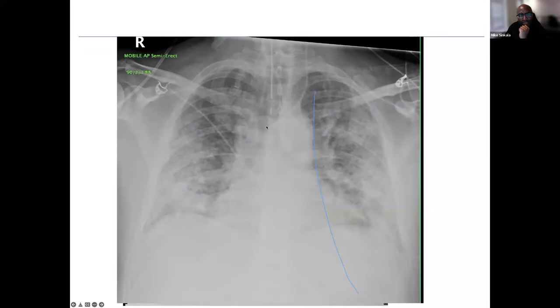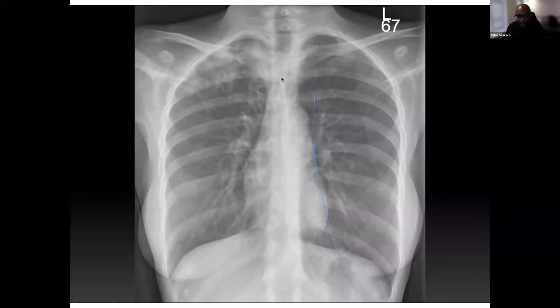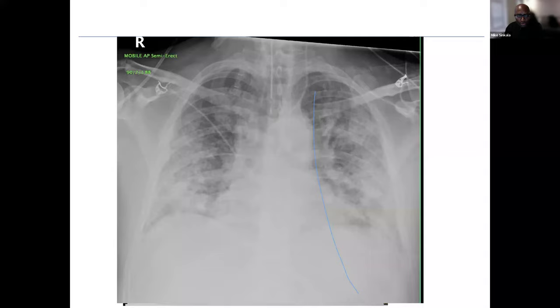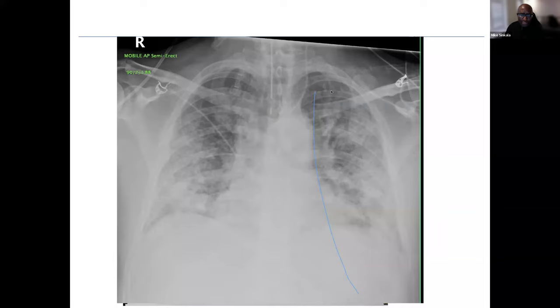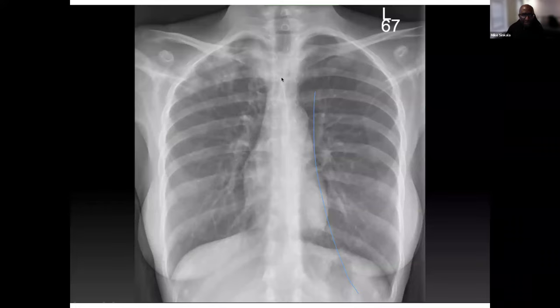It has been resited to the junction between the brachiocephalic vein and the superior vena cava there. But the rest, again, look at that. The tracheostomy tube has been pulled back into its rightful position, because the previous one here was too low. It was too low to ventilate both lungs. So a patient possibly could have one of the lungs collapsing. So when you're looking at these X-rays, always look at those kind of things.